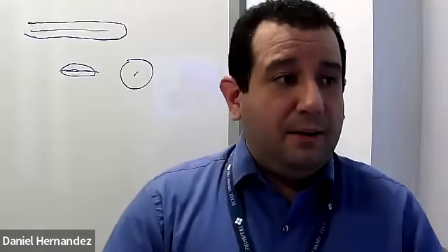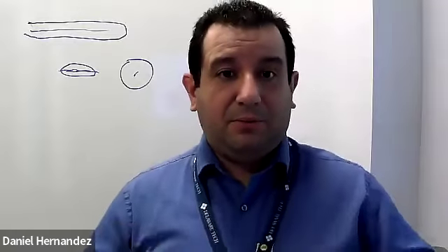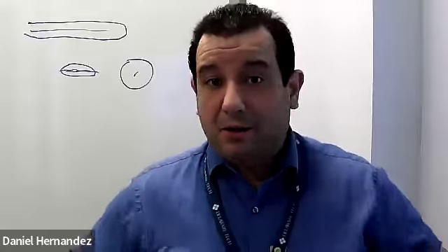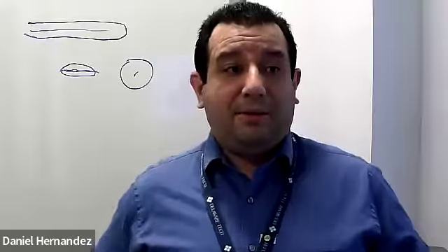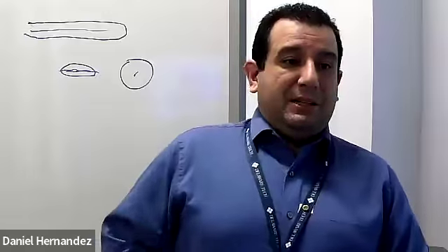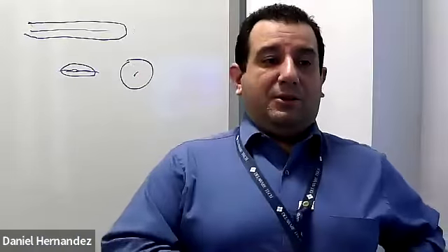The vast majority of intussusceptions involve the terminal ileum and the cecum, so the ileocecal junction is where we primarily look for these intussusceptions. With that being said, they can occur anywhere along the path of the large intestine. So you can start in the right lower quadrant, look for the terminal ileum and cecum, the ileocecal junction, and work your way up, and then across and down.